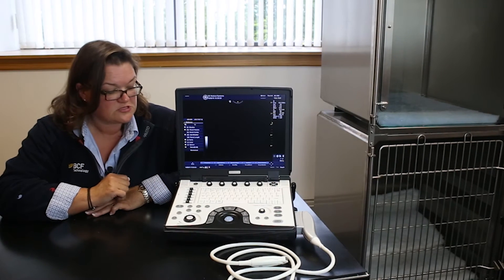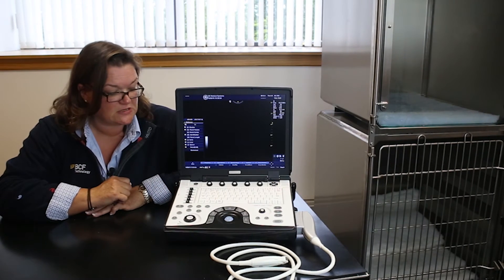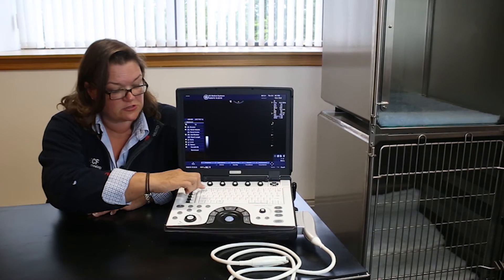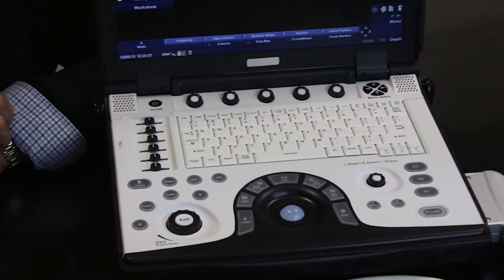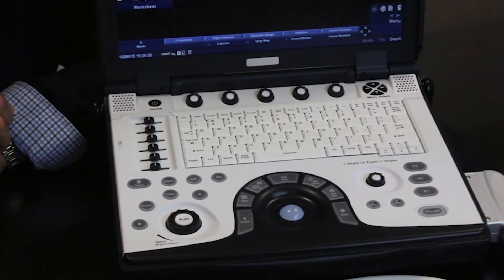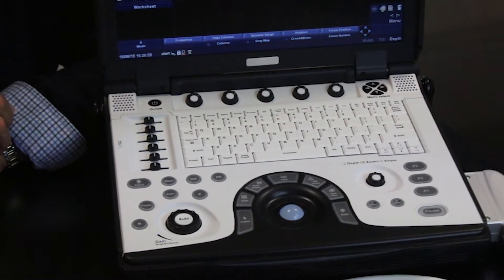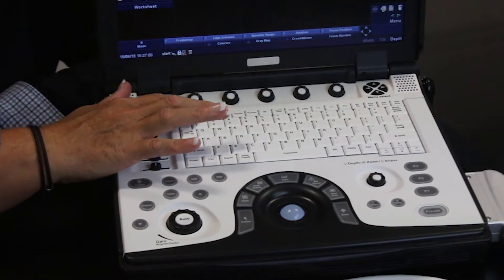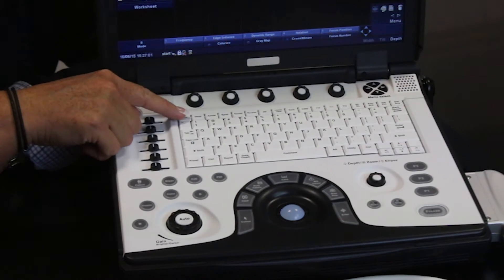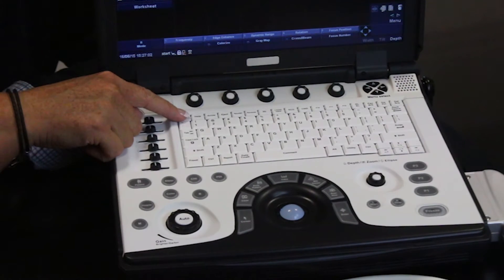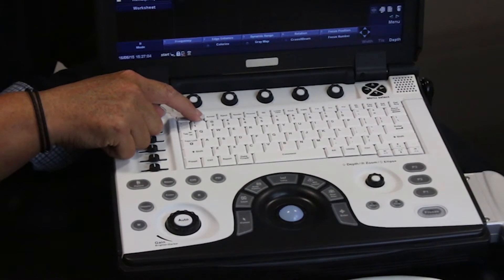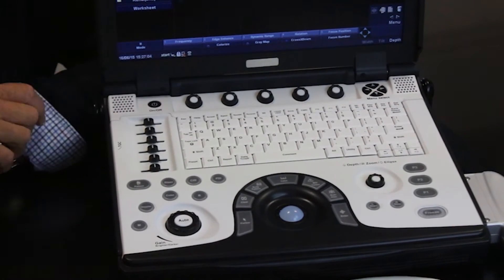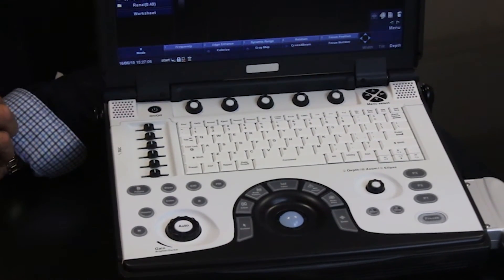We also have function keys that run along the top of the alphanumeric keyboard. The help button here brings up an online searchable owner's manual.